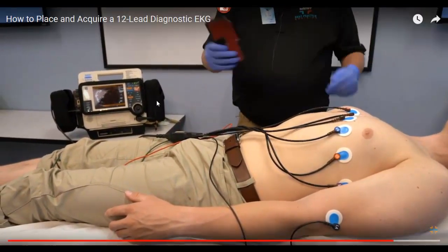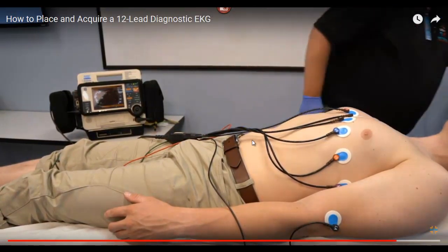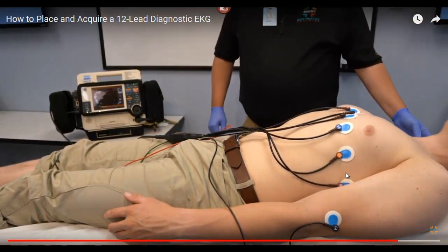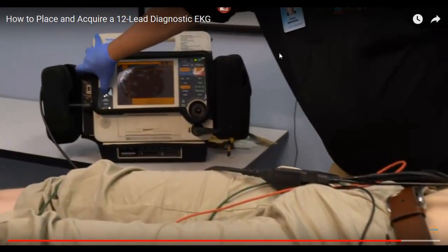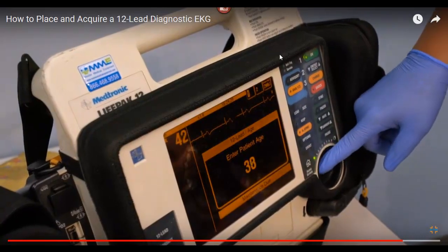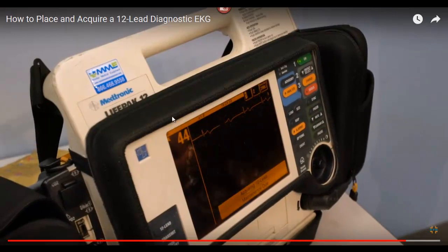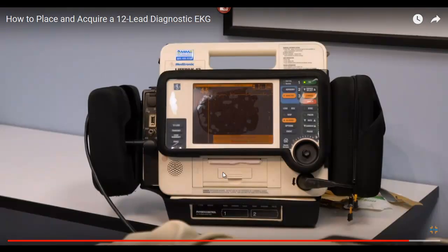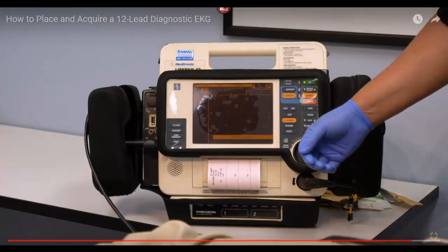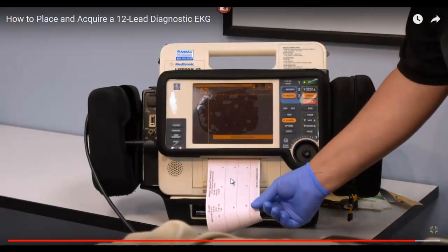Anyway, when you push this button, you can change the different channels on that machine to show all different views of the heart. So if you've never seen an EKG machine, there he goes. He's pushing it. He's adjusting. That might be the gain. It looks like that's the guy's heart rate. Good Lord. But there it comes. And look, today most ECG or EKG machines are digital, but there are some that still give you a printout sheet.